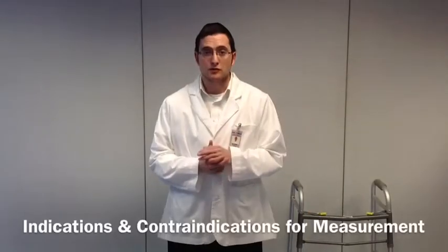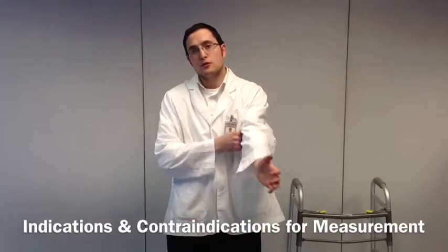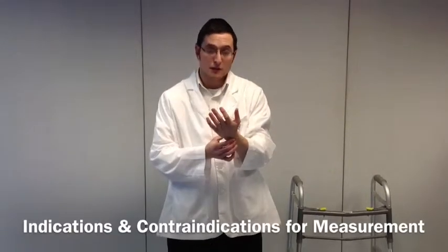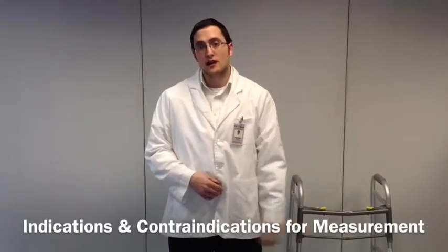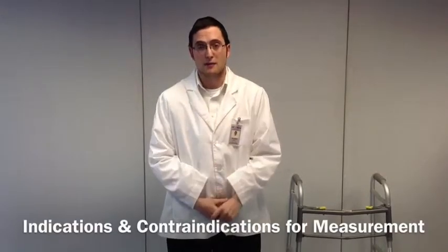Indications for measuring ulnar deviation with a goniometer would be where somebody has an observable limited range of motion of the wrist, either due to general tightness or to an extended period of immobilization. Contraindications would be where somebody has a suspected wrist fracture or pain intolerance.